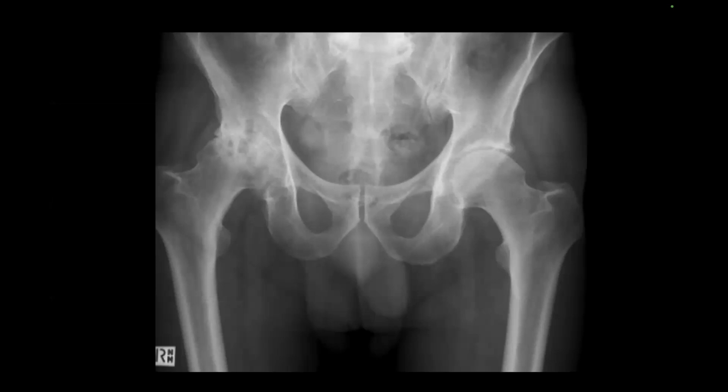And then this is an asymmetric process. Worse at the right hip, there's complete disruption of the joint, cystic changes, and sclerosis with osteophyte formation. So in this case, you wonder whether there has been a secondary event.